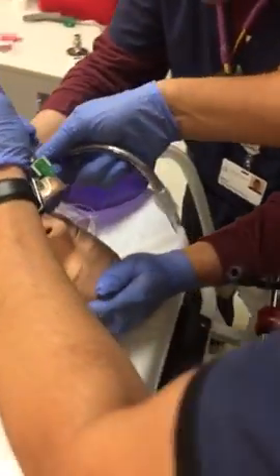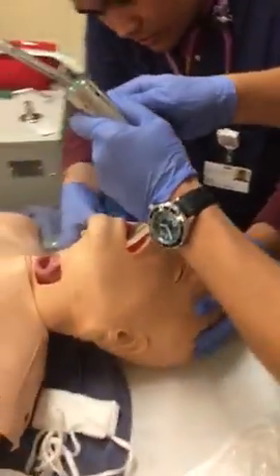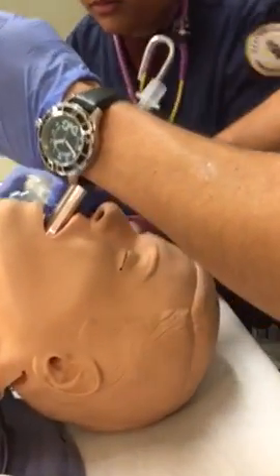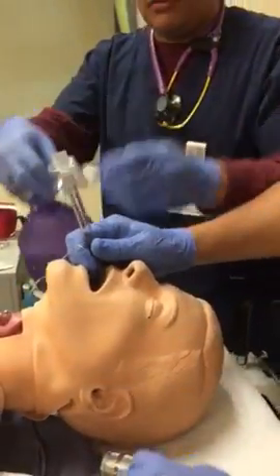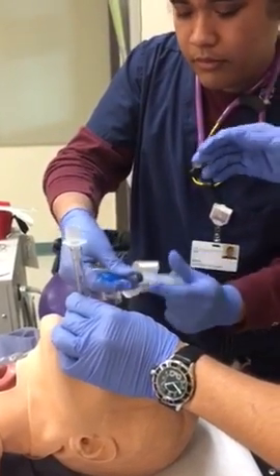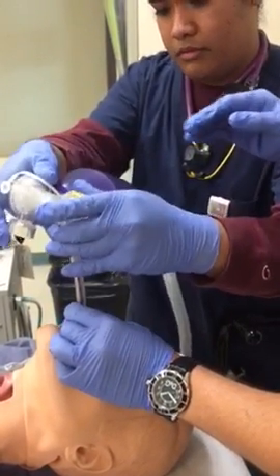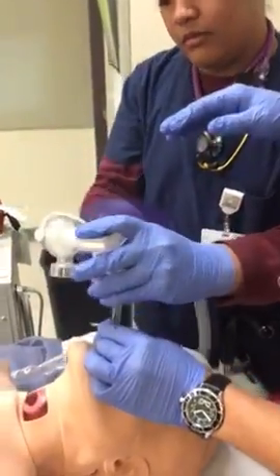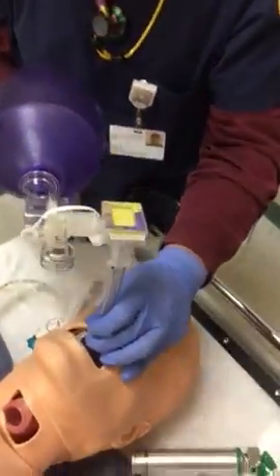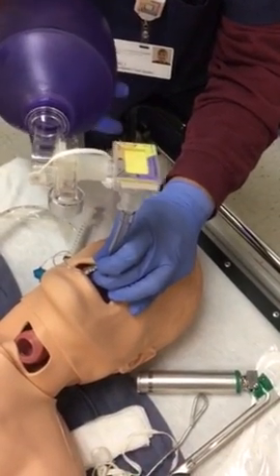So I would place the blade in, put the tube in, come out with this, style that out. That is inflated. He's going to secure the tube. We're looking for gold on the capnograph.